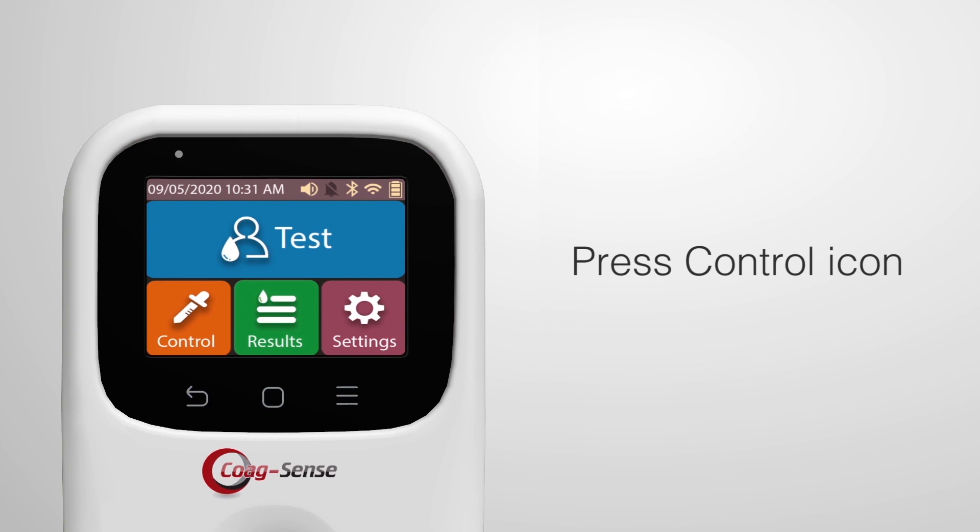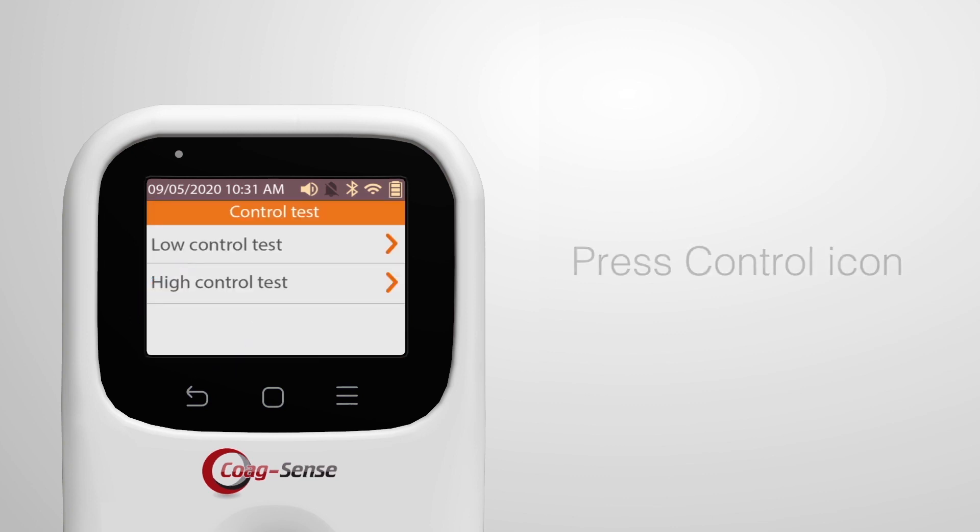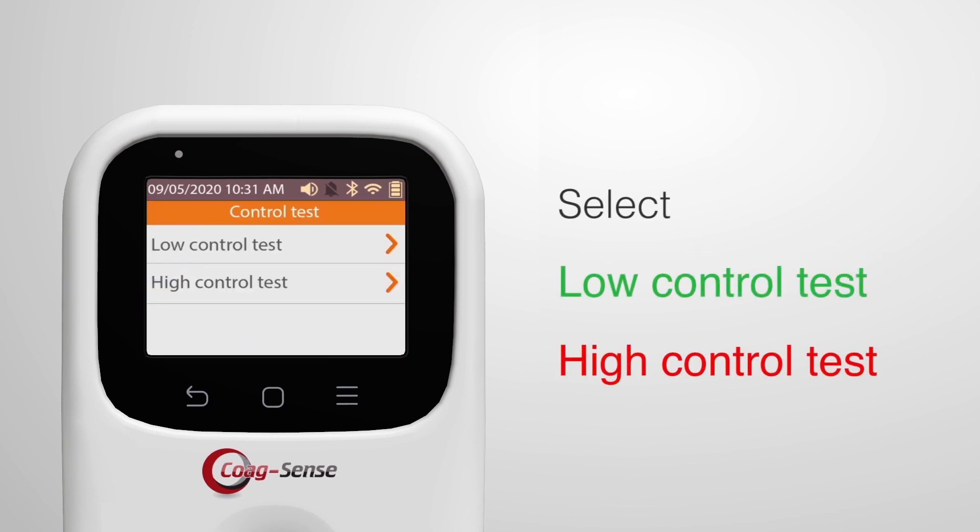Press the control icon on the display. Select from the following two options as applicable: Low Control Test or High Control Test.